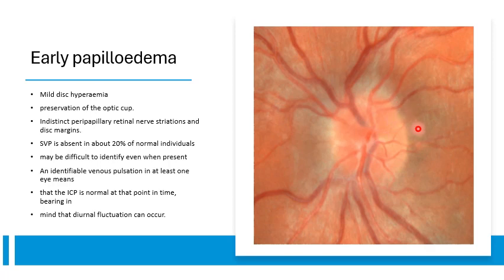The margins of the optic disc will be slightly obliterated and ill-defined, not like in a normal optic disc. Spontaneous venous pulsation, if it's seen, negates the presence of papilledema. Absence of spontaneous venous pulsation cannot confirm papilledema, but absence of a previously recorded spontaneous venous pulsation indicates a raised intracranial pressure. So if one doctor documented that he or she has seen spontaneous venous pulsation and a second doctor came for a second exam and did not find this, this is a sign of early papilledema.